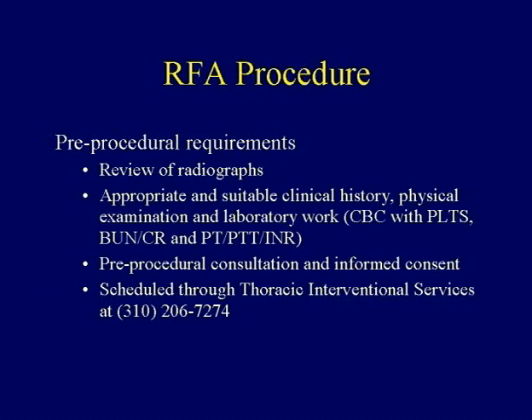Just a little review on the RFA procedure. Pre-procedure requires a good consultation between the radiologist performing the procedure and the patient. This is not a minor intervention. In fact, as I'll show you images, the first couple of cases I felt were fairly aggressive in their side effects within the lung, but it turns out that in fact the lung is an amazing organ and tolerates the procedure extremely well. But nevertheless, these are one-on-one consultations with the patient.